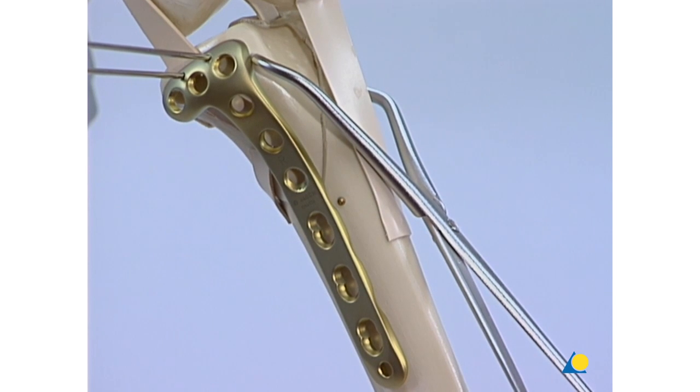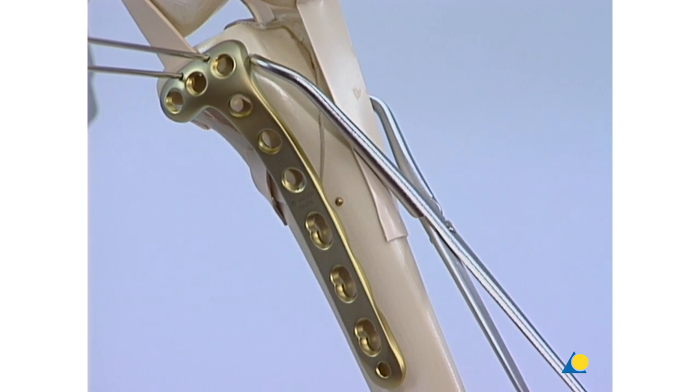Before placing any screws, it's advisable to check the quality of the reduction with x-rays in two planes.